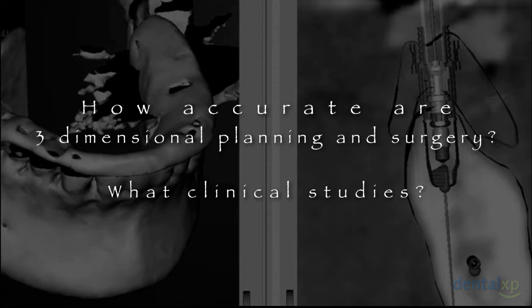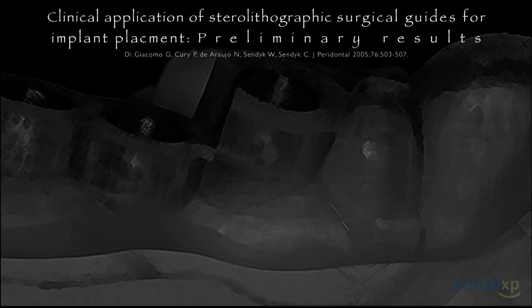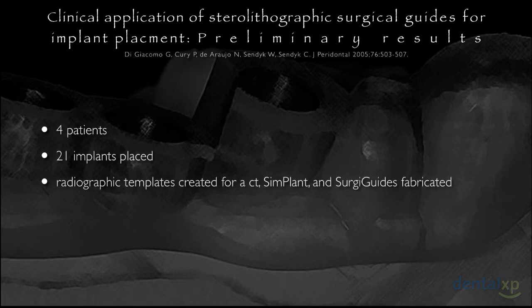Well, now that we understand about the two different types of templates, what are some of the studies clinically? Well, unfortunately, there are very few clinical studies. In fact, my knowledge is of only one clinical study, and that's by Di Giacomo, and this goes back to 2005. He looked at 4 patients. 21 implants were placed on these 4 patients.